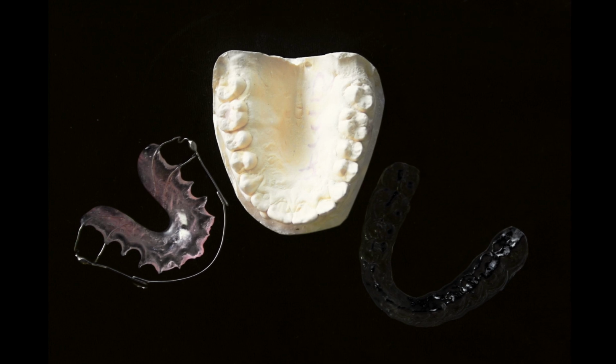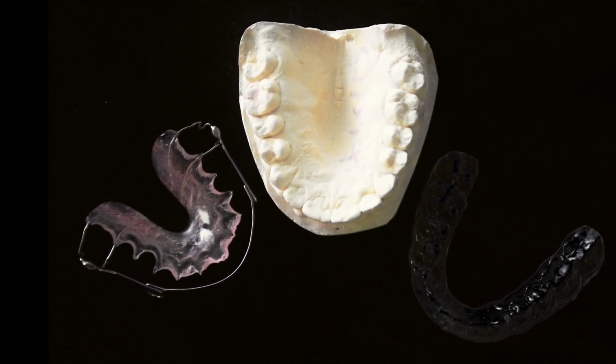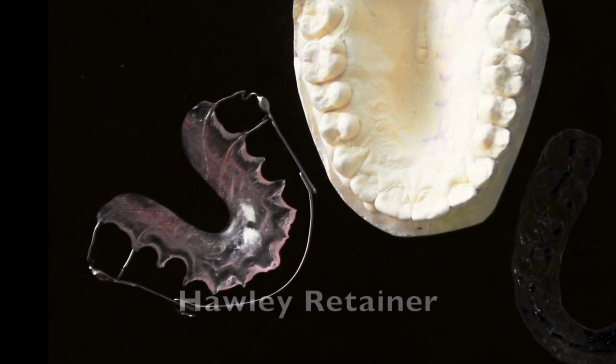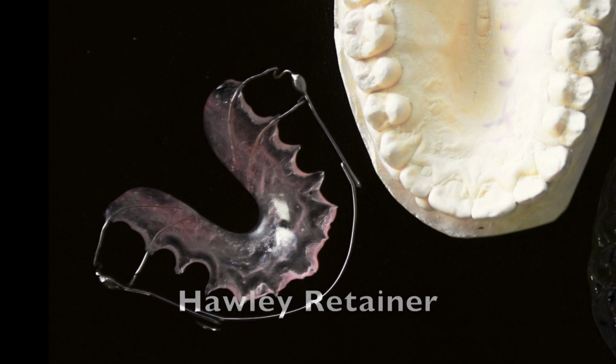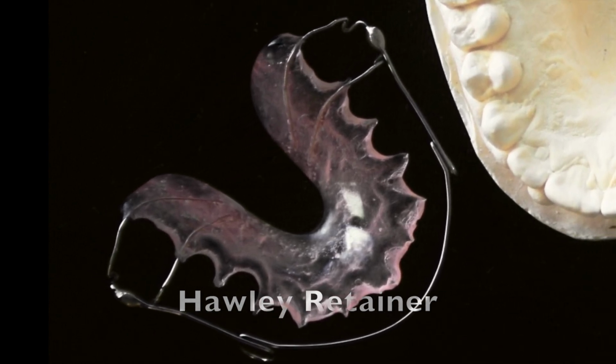The other type is the Hawley retainer, which is probably what adults would now remember as the old school type of retainer, which is stronger, lasts longer, but evidence shows that it doesn't keep the teeth quite as straight in the long term. So generally for that reason we tend to lean towards Essex retainers.